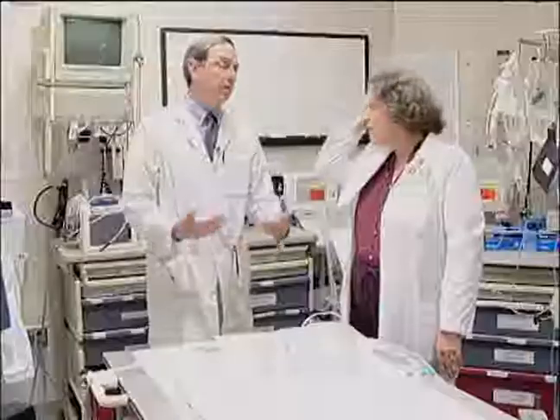So other things that we do are the adjuncts, metered dose inhalers. Somebody has asthma, chronic obstructive lung disease. We give those to the patients that are in here, ventilated as well as non-ventilated patients.